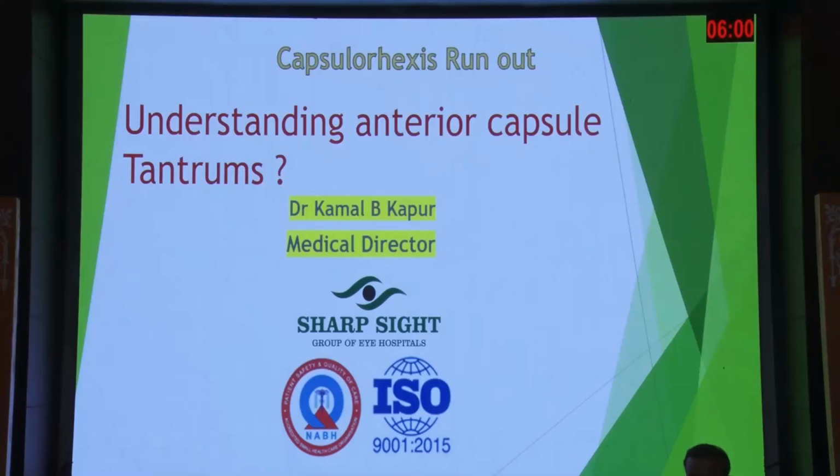Okay. So I'll be talking about capsulorhexis run out. Before that, we'll try and understand what are the tantrums the anterior capsule can play. Most of us are talking about posterior capsule and zonules. The poor anterior capsule is often ignored because we take it for granted.